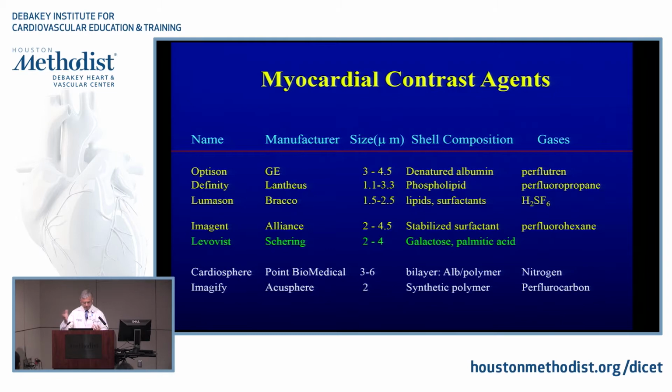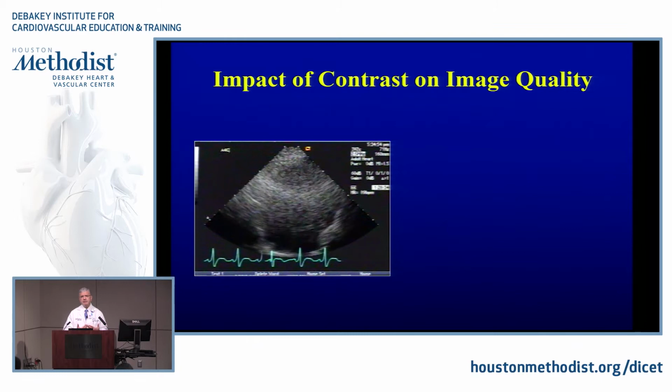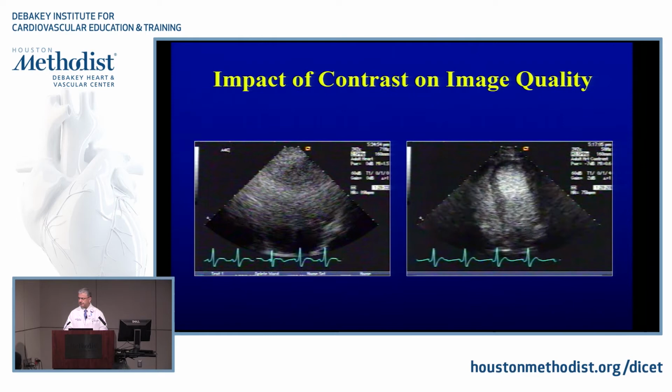And the beauty of these agents, the newer ones obviously, is that they can traverse to the left side and make something that is uninterpretable, just like you're seeing right now, into an interpretable examination. I mean, that's the beauty. And this is from our early studies, believe it or not. I can't remember the date, but certainly 10 plus years ago, the field was amazing.